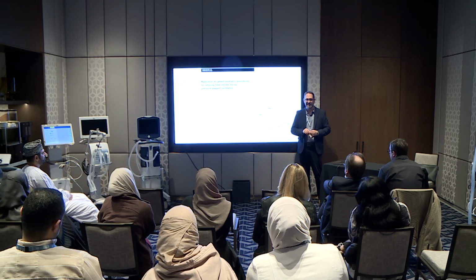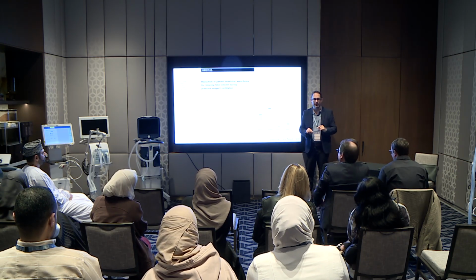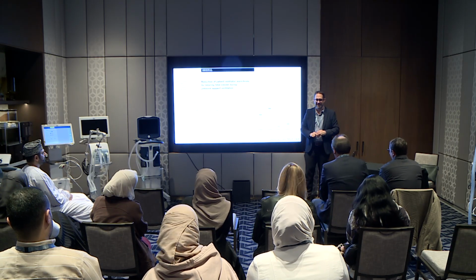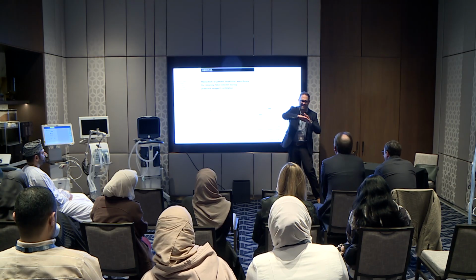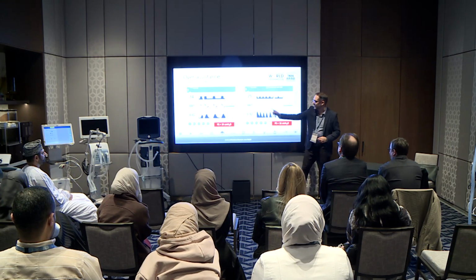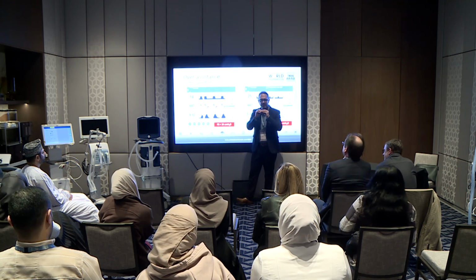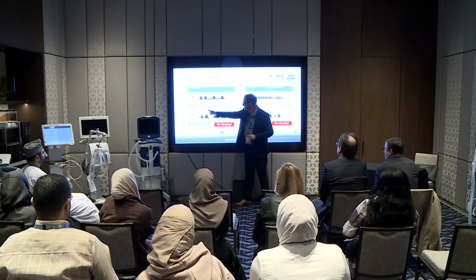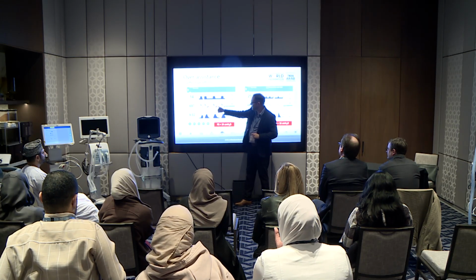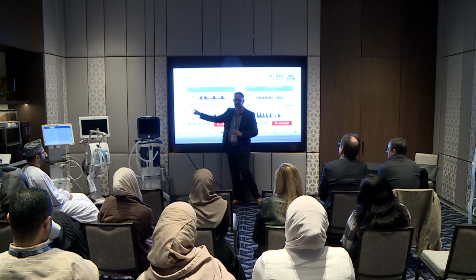So Martin had mentioned earlier, that's actually normal tidal volume. For years we've been calling it low tidal volume and it's been driving me crazy because if you look at the data, mammals on average breathe 6.3 mils per kilogram of predicted body weight. Whether you're a mouse or a whale, 6.3, that's the line. So if you have 10 mils per kilo of tidal volume, like this patient here, you see this effort? This is how you look for PMUS, evidence of effort. The flow has a nice decay, but then it goes down, you see this, and then it goes down. So close to triggering the ventilator, but not quite. They're too hyperinflated.